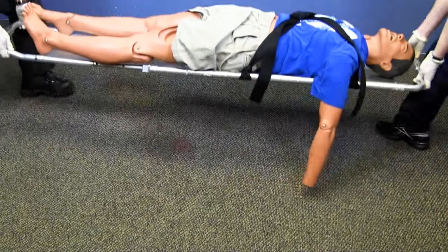Using a scoop stretcher can help move patients who may have long bone or pelvic injuries. These patients do not tolerate a lot of movement, so being able to slide the equipment under them can make movement much easier. Good luck and stay safe.